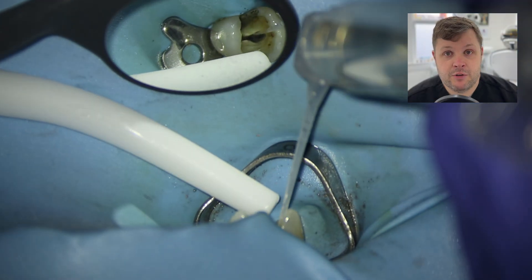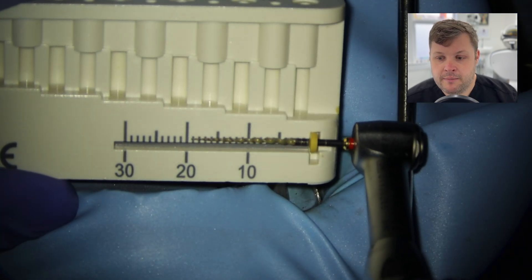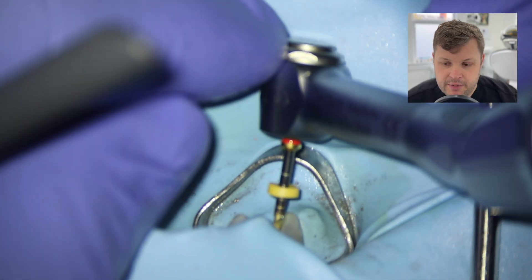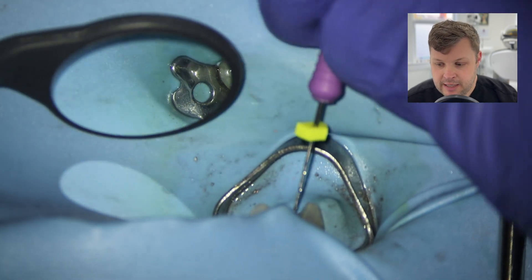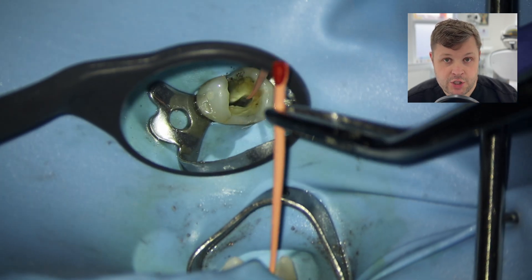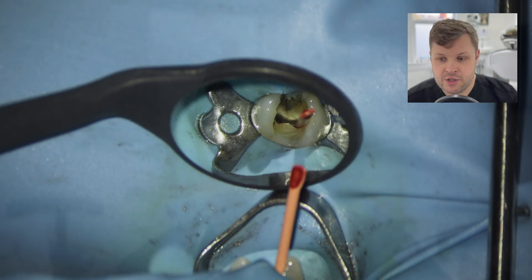I re-irrigate the buccal canal, get my master apical file and fit it to working length, and take my time to make sure it's properly shaped — a bit of recapitulation with the size 10 D-Finder and lots of irrigation. When I recheck the GP point, it goes successfully to length. That tooth is boxed off and sorted.